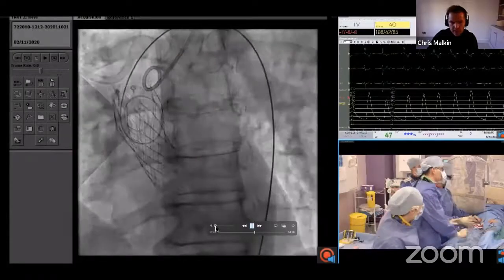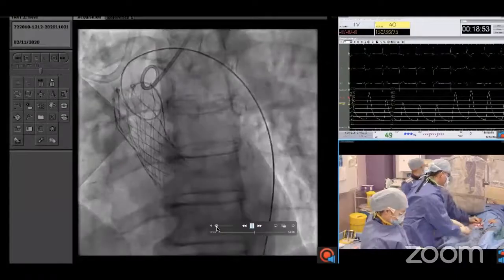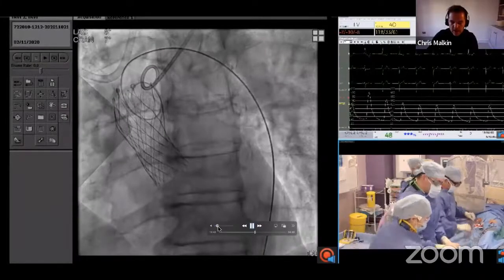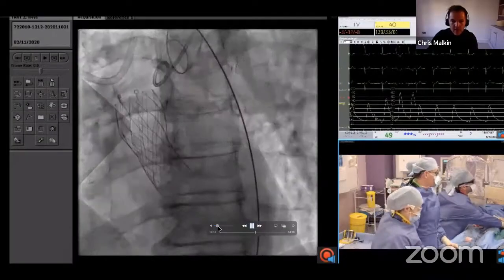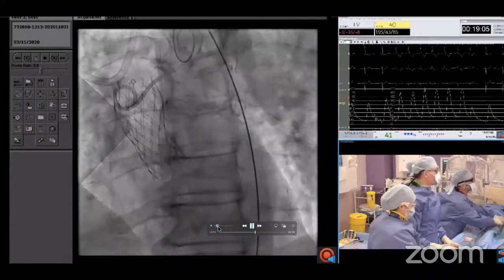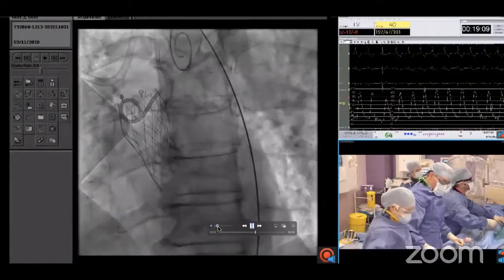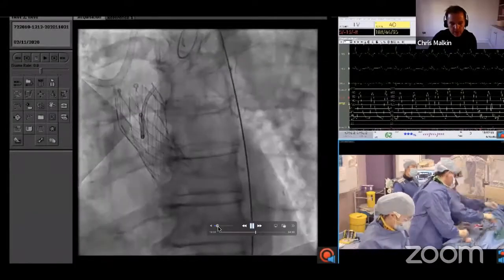My colleague pulled the wire out. I told you this case wasn't perfect. I think that was merely a factor of just the size of the LV cavity just allowed the LV wire to come out. And it's one of those unforgivable things in interventional cardiology is pulling the wire out. But we do an aortogram now because I was so sure that the valve result would be good.